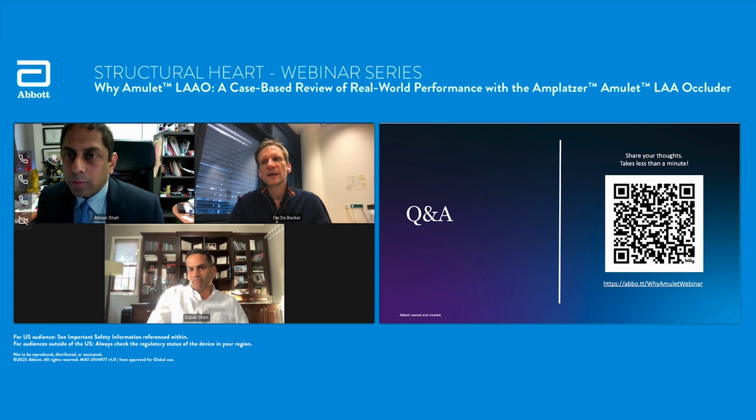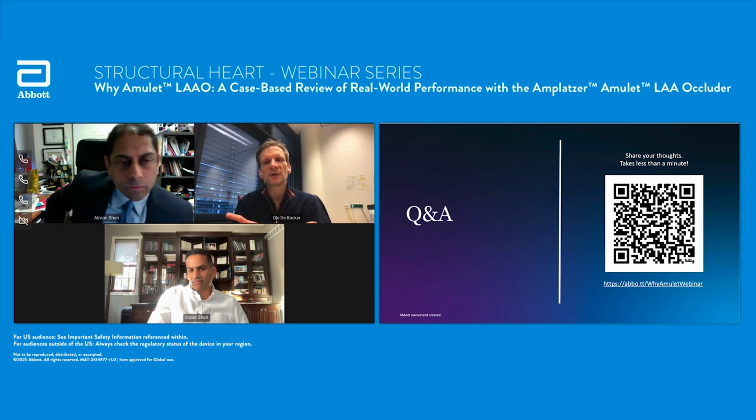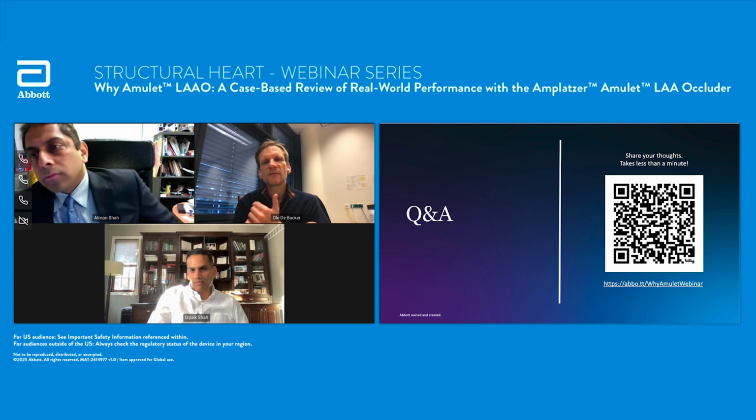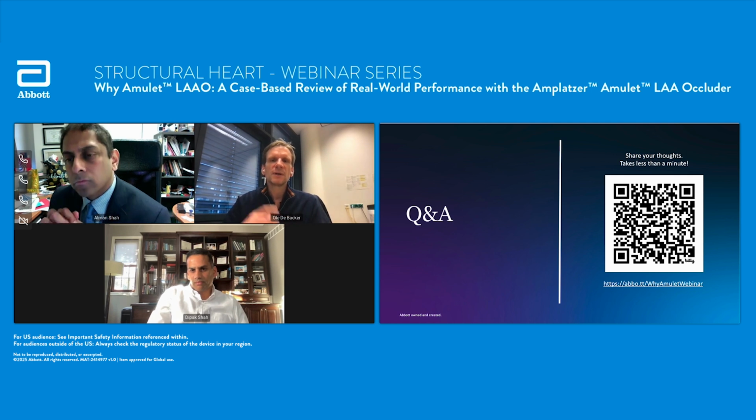Fully agree. And if I can add on this, coaxiality is absolutely the number one thing I want to obtain, because if you can get really proper coaxiality of your device, that's the recipe for complete closure. Typically, if you have off-axis implants, those are the cases where you have remaining residual leaks. Of course, the Amulet is very forgiving. You don't have to be perfect with your coaxiality with your lobe.